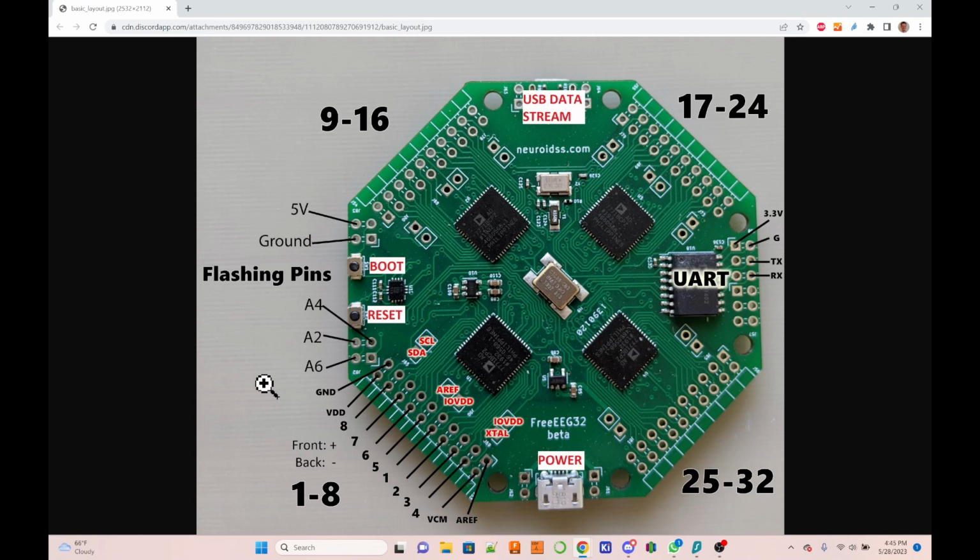So what you can actually do here, if you wanted to, you could make every single electrode a bipolar setup. Which with SRB2 you cannot. With SRB2 you could put the SRB2 on a different location, but then all of the channels will have their negative pin on that location. The way to consider the difference between this system and the SRB2: every single channel on this board has 2 pins, a positive and a negative pin. The positive pin goes on the location where you want to measure, and then you have to place the negative pin elsewhere. And consider these 32 channels that we have.